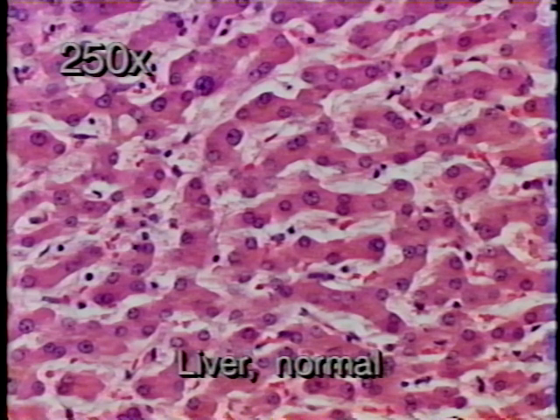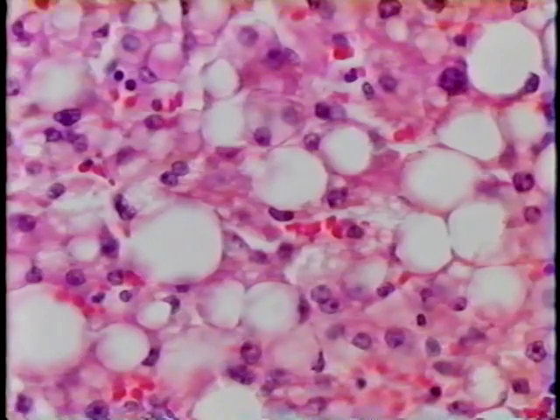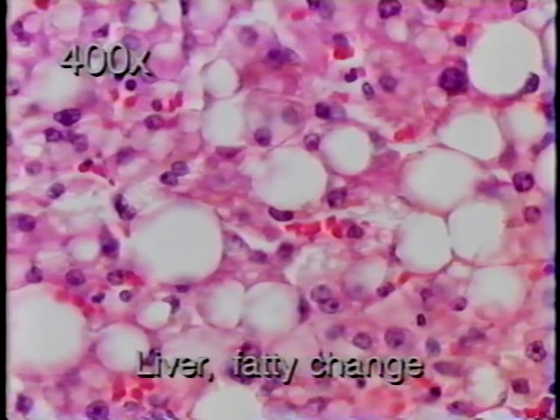This is a section taken from a normal human liver. Note the cords of hepatocytes with eosinophilic cytoplasm. Now you see the same tissue under higher magnification. Notice that the cell nuclei are mostly round and located near the centers of the hepatocytes. Examining injured hepatocytes, notice this nucleus, which is deformed and displaced to the periphery of the cell. This large, clear vacuole represents a globule of lipid. Since lipid is hydrophobic, all of the hydrophilic cell components have been displaced toward the cell membrane.